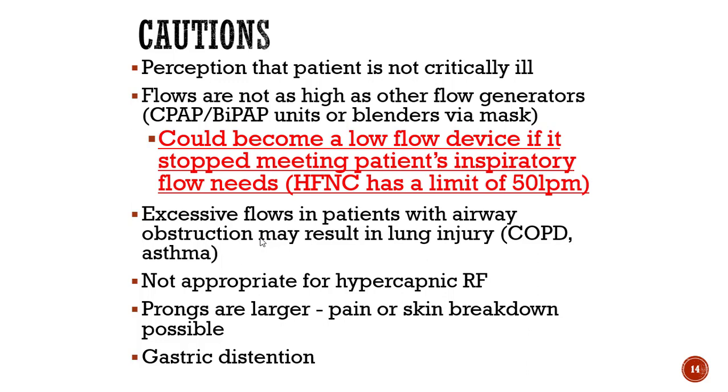end stage emphysema, we're just going to go that route, where they have blebs and their lungs are kind of deteriorated, where there's more air trapping and the alveolar sacs have been damaged and are starting to merge together. If you put them on high flow nasal cannula, those high flows could create more blebs, is what it's saying. I've never seen this be a limit to anybody wearing one. So although it's on the manufacturer warning or contraindications, this is not really something we take into consideration at all, either in a clinical setting or on the boards.